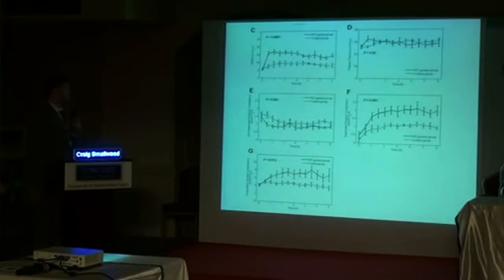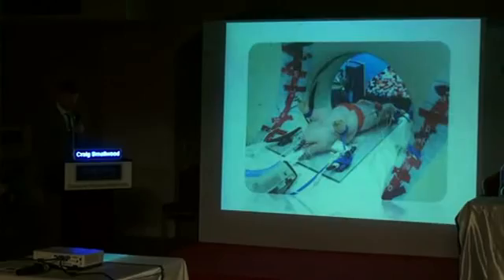And you can see some other pulmonary mechanics as well. The dependent regional compliance, that would be the regions 3 and 4. You can see there were differences between the groups there, as well as the total respiratory system compliance, which we think is more of an indicator of what is going to happen in the global respiratory system compliance. This would be from EIT, this would be from the mechanical ventilator.